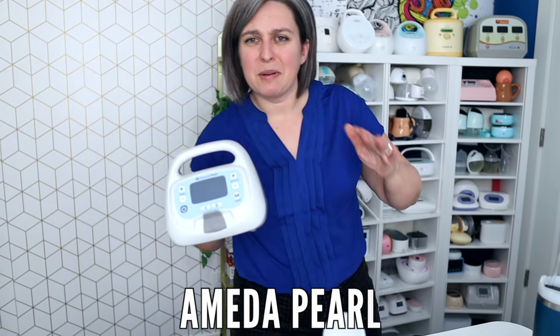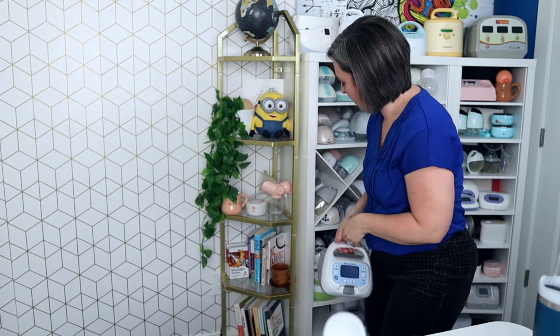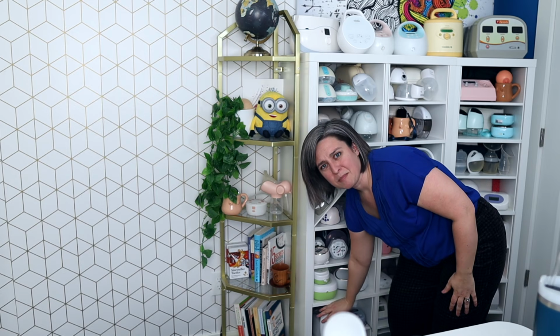The Ameda Pearl is probably another one that I would put on the good suction list. We don't really talk about that one a lot. Another dual motor pump designed for hospital use. It's a multi-user pump, so that's another interesting one as well. There are a lot of pumps that have great suction, right? Suction is like one of the main functions of a pump. So don't get me wrong, there are some other really nice options here. But if I'm thinking like high quality and good maximum suction, like consistent performance, those are probably the ones. Those are the ones I grabbed first anyway.